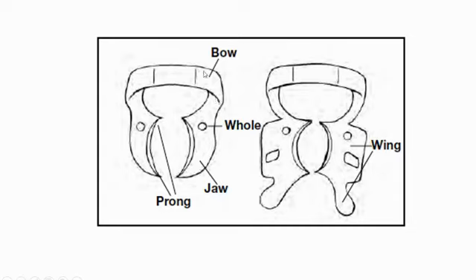तो इसमें क्या क्या याद रखना है, एक बो है, दो जॉज हैं, होल्स हैं to put the clamp forceps, say rubber dam forceps, I'll tell you. And these are the 4 prongs. These 4 prongs are very important because these 4 prongs will be touching on the buccal and the lingual surfaces and will be stuck or anchored. Basically anchored हो जाएंगे टूथ पे, और वो clamp जिसकी वजह से शीट भी आपकी अडहेर रहेगी. तो देखा आपने दोनों में there are 4 prongs, there are holes.